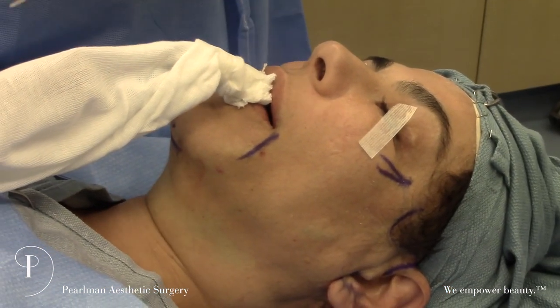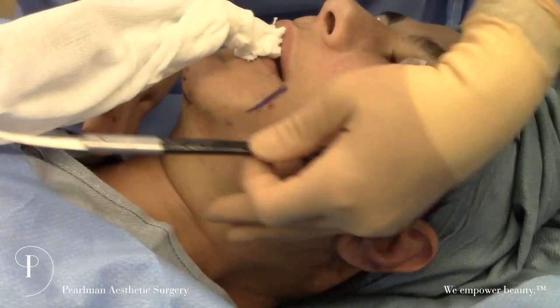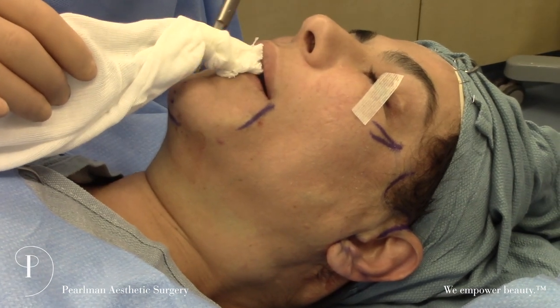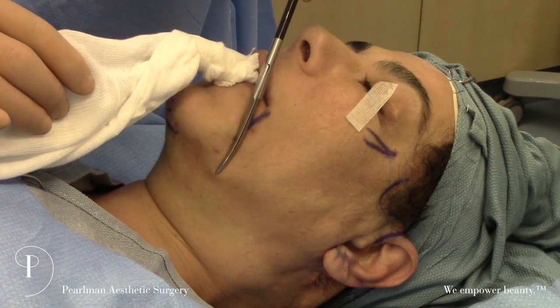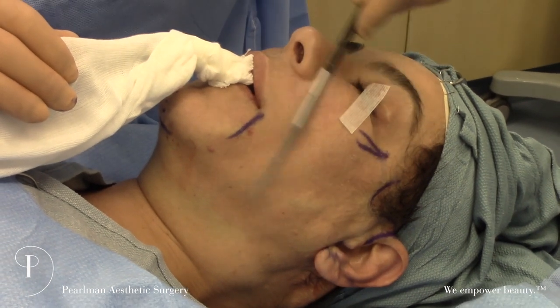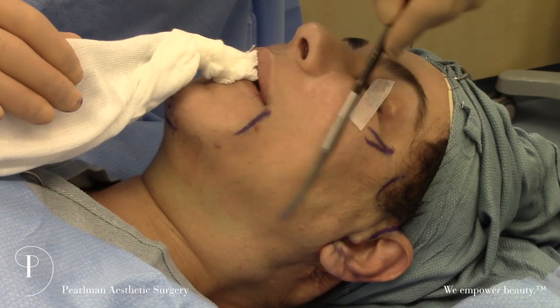This allows us to connect from ear to ear and achieve a nice draping of the skin. I'm going to come up and release the mandibular ligament right here. This ligament creates an attachment point where the jowl falls over it, so in addition to pulling backwards with our D-plane facelift, releasing this ligament will help to improve the jawline.